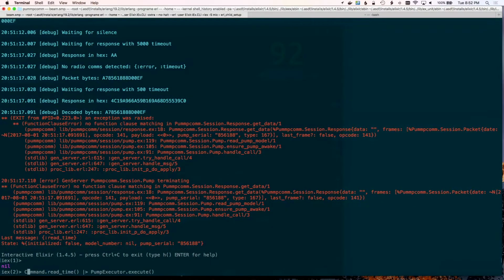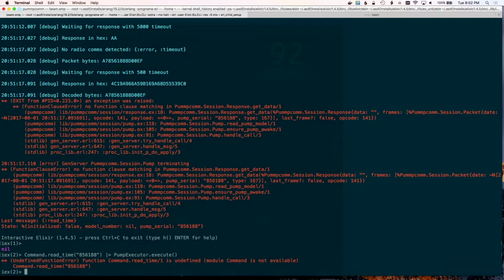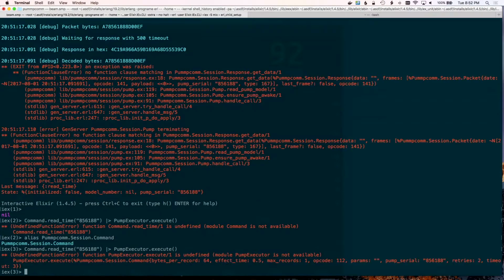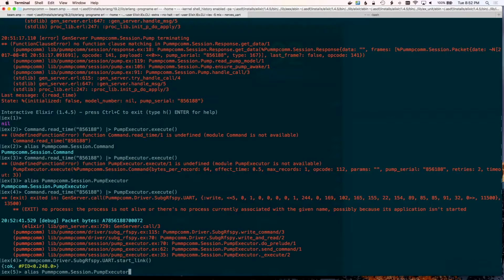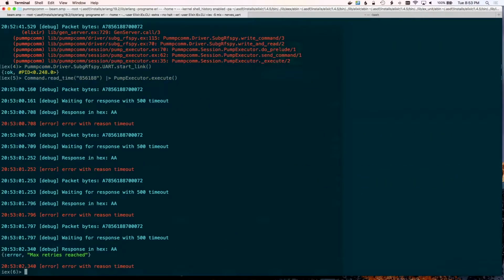Gonna try going a little bit lower level than the gen server here. All right, it looks like underneath me my UART crashed. So both of the gen servers on the top and on the bottom crashed. This is gonna be fun. All right, so the pump's not awake. I need to wake it up first.